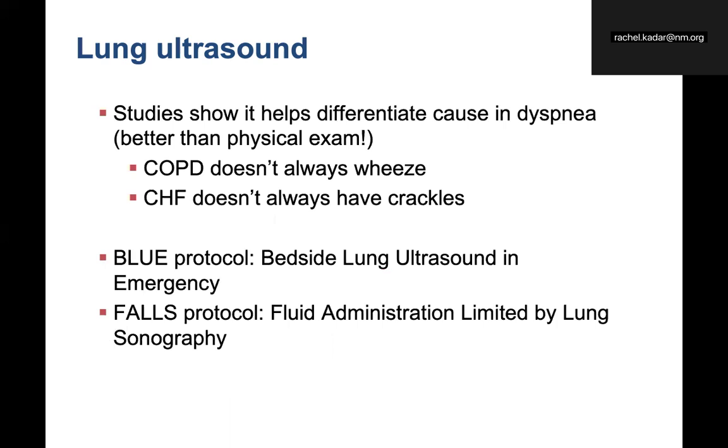Why do we do lung ultrasound? Studies show us it helps differentiate the cause of dyspnea. It can be better than the physical exam. So COPD doesn't always wheeze, CHF doesn't always have crackles. In addition, I like to use lung ultrasound in the intensive care unit to see how my patient is progressing day after day. If I'm diuresing them, how do my B lines look? How are my pleural effusions? Am I moving in the direction I'd hoped? And does that correlate clinically with how the patient's doing?